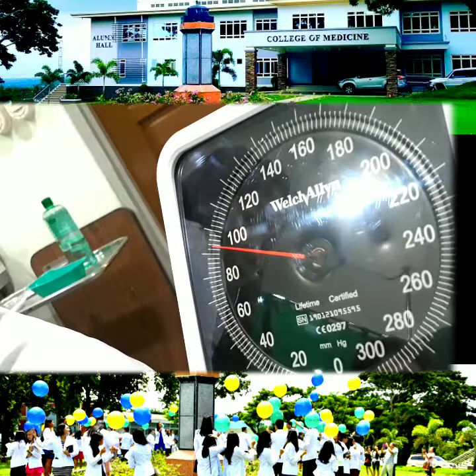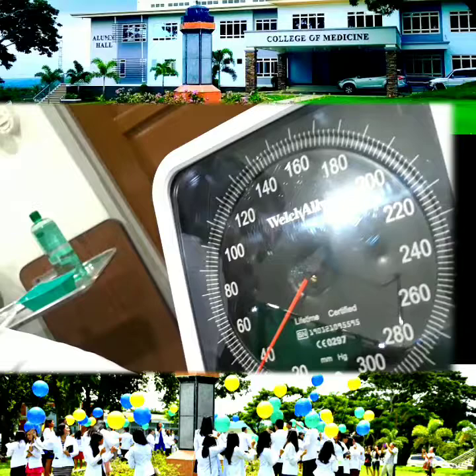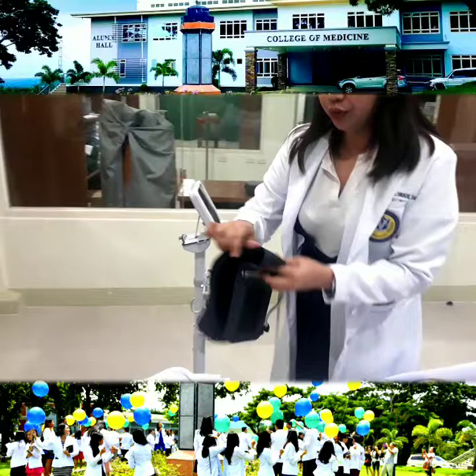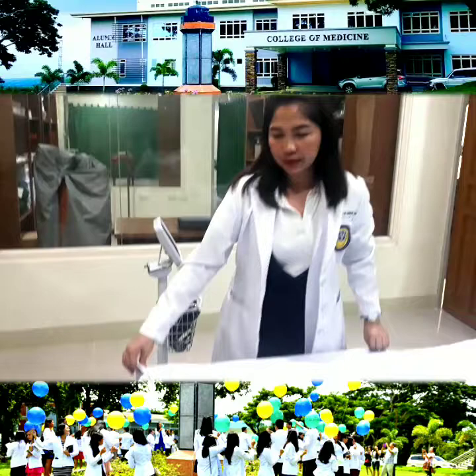The first Korotkoff sound that you will hear — that's 100, which is your systolic. The last Korotkoff sound that you will hear is at 70, your diastolic. So the blood pressure of the patient is 100 over 70. Remove the cuff and put the patient back to a comfortable position. Thank you, Mr. Smith, for accommodating us. Have a good day. Then go back to the station and write down your reading.